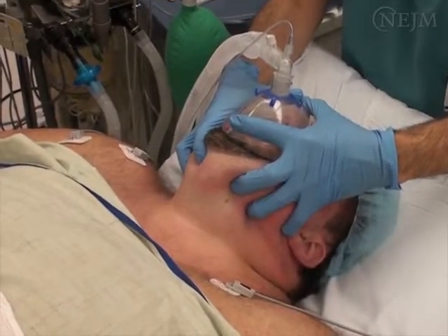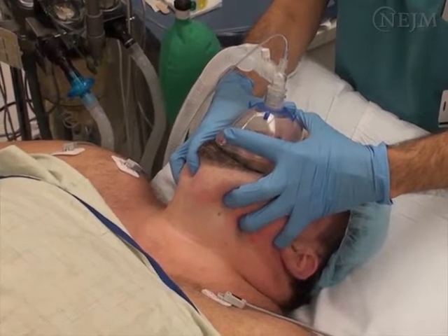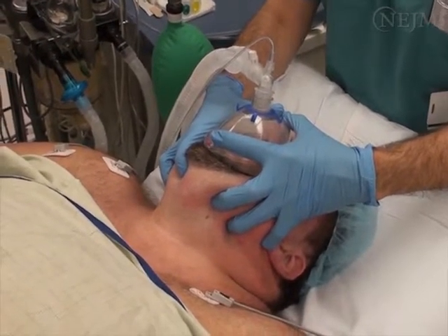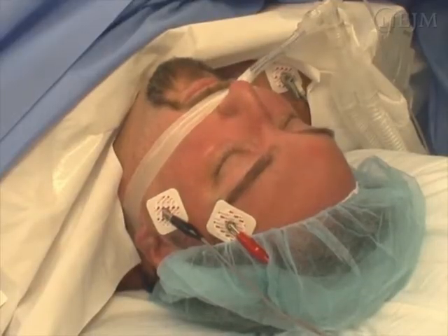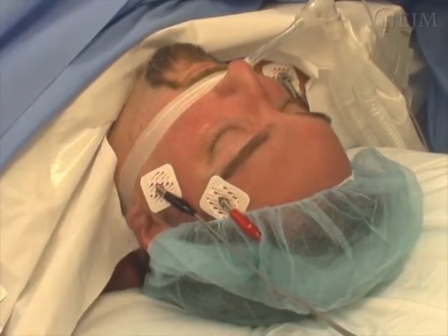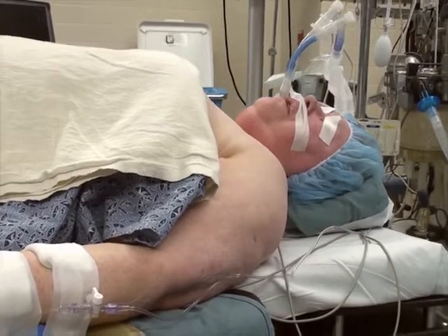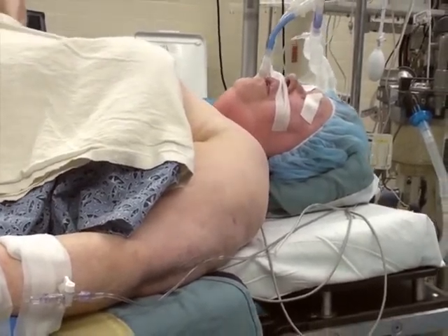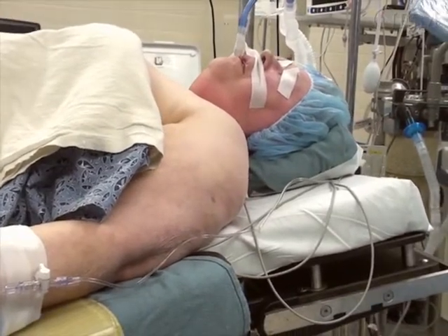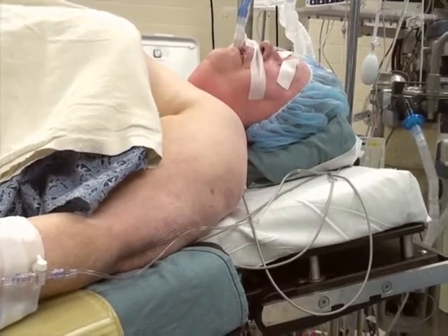Extubation of morbidly obese patients who have obstructive sleep apnea must be accompanied by enhanced readiness to support ventilation and maintain airway patency. Be sure such a patient is fully awake and able to respond appropriately to commands before extubation. Upright positioning of the patient is strongly recommended so that the excess body tissue on the chest and against the diaphragm is displaced caudad, which will reduce the work of breathing and increase the functional residual capacity.